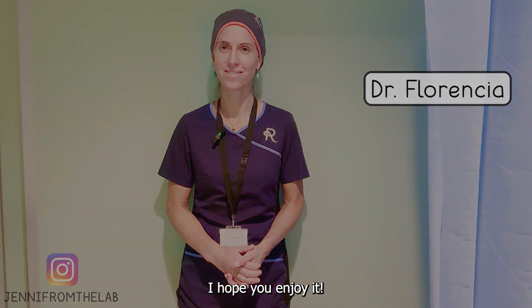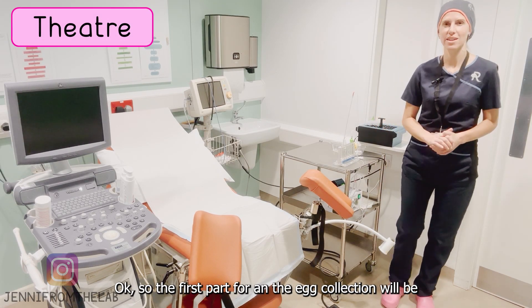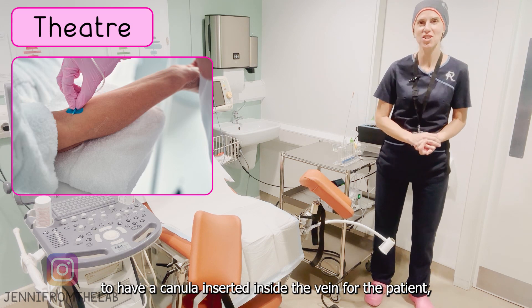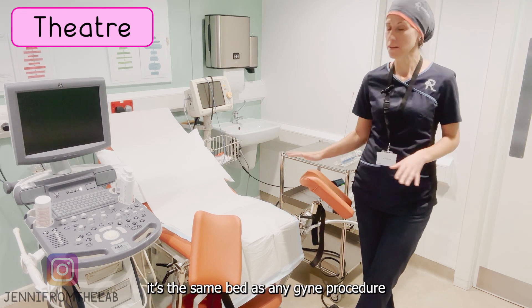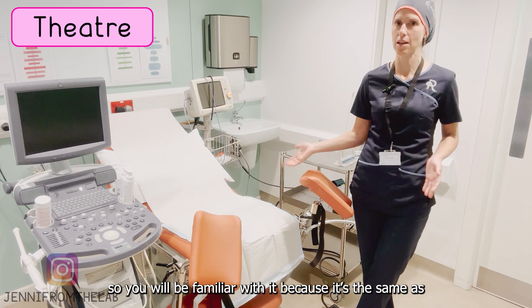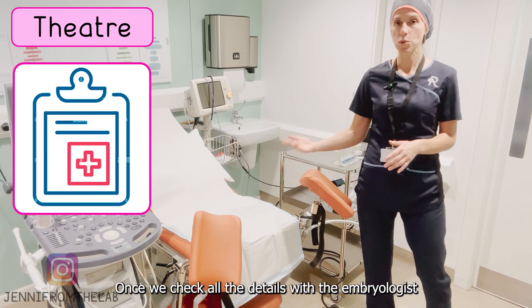The first part of an egg collection is to have a cannula inserted inside the vein for the patient. She'll then be brought to theater, and this is the bed we use to collect the eggs. It's the same bed as any gynae procedure, so you will be familiar with it — it's the same as you would have for, for example, a smear test.